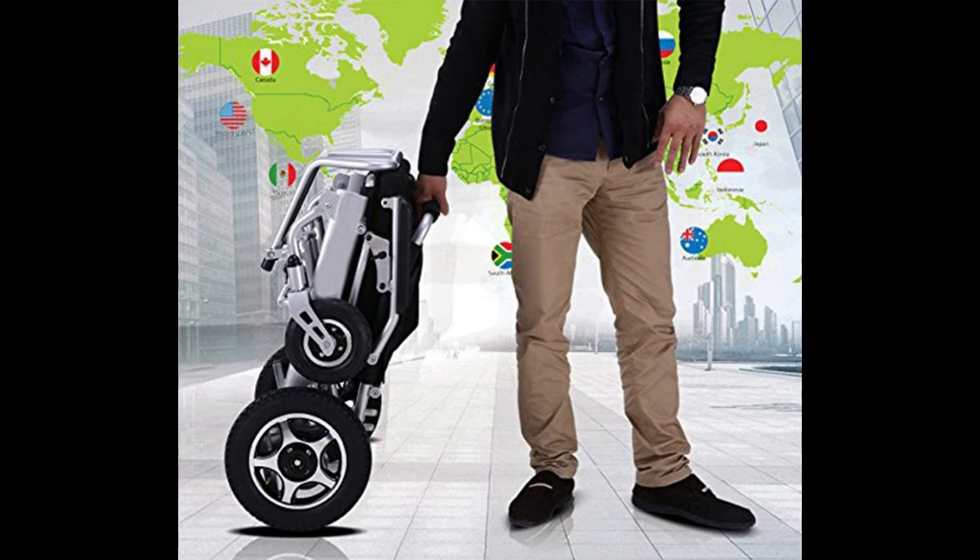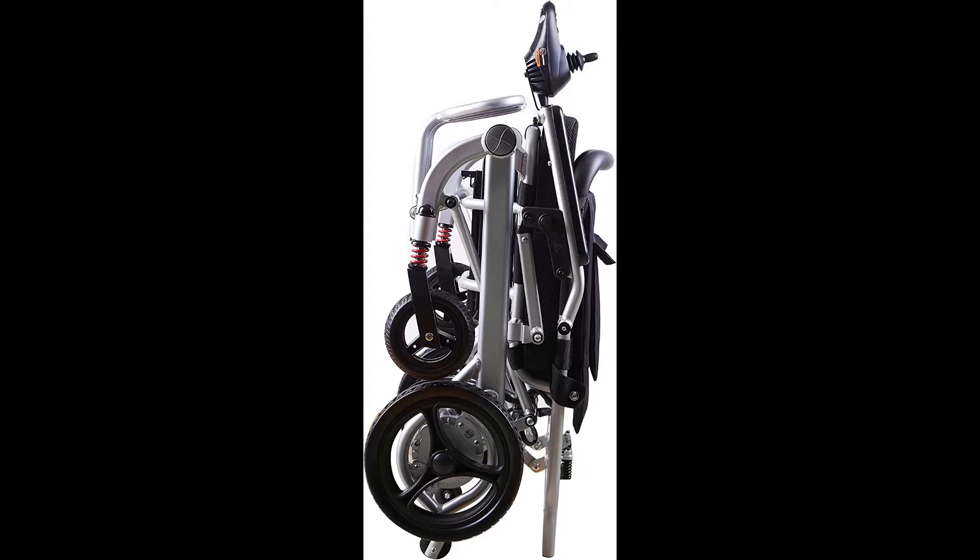The Super Lightweight Folding Electric Wheelchair has been nominated the lightest foldable power wheelchair, weighing only 43 pounds. It is designed to provide a versatile and convenient wheelchair, ideal for comfortable mobility support through all areas of life — indoors, outdoors, and on the go.